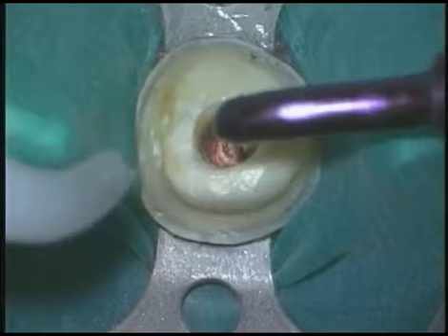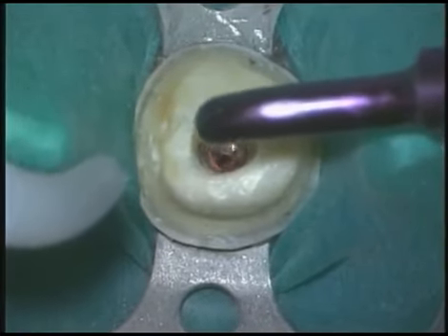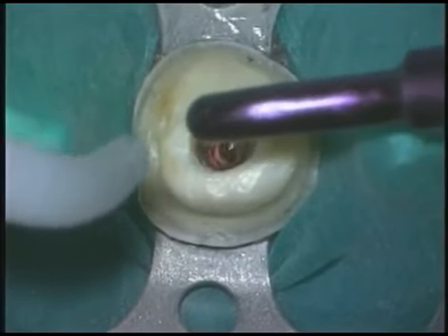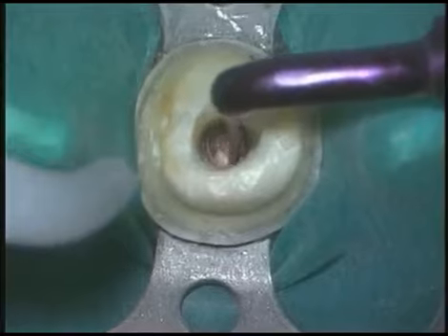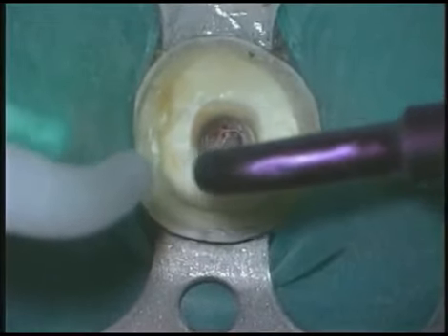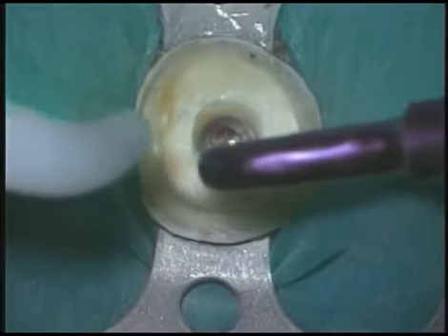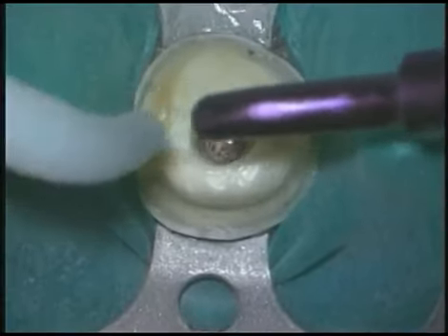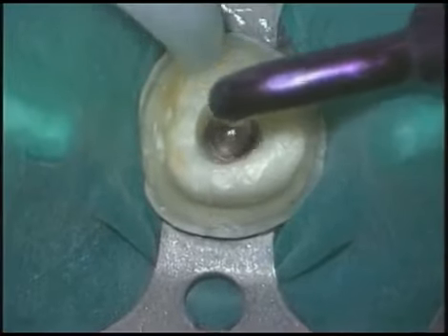Titanium endo-ultrasonic instruments are used because their small profiles work deep in the root canal space. Importantly, their small profile gives us unsurpassed vision. The instrument's smooth cutting action and high tip energy allows us to thermally soften gutta percha. By softening the gutta percha, it allows the tip of the ultrasonic instrument to progressively work circumferentially around the broken obstruction.